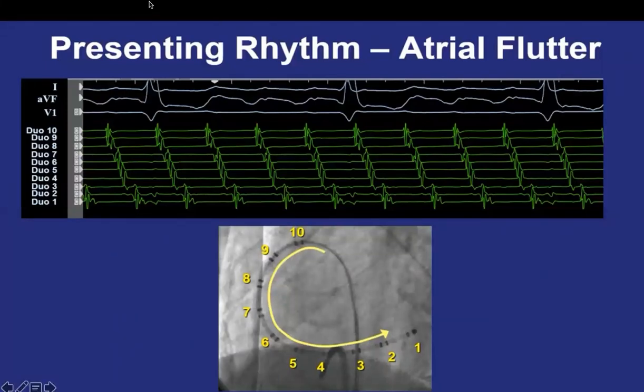One last question, Dr. Ahmed. I want to clarify some point. I understand the early activation is different in a patient with pacing and non-pacing. I will see the ventricular signal in patients non-pacing. Is pacing the same, or do I see the atrial signal for the early activation decision? For the atrial flutter or in general, accessory pathway or AVNRT?